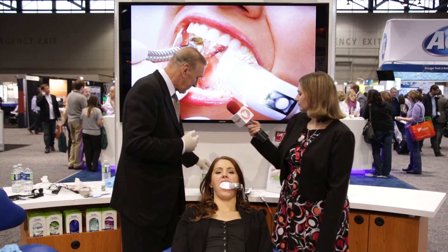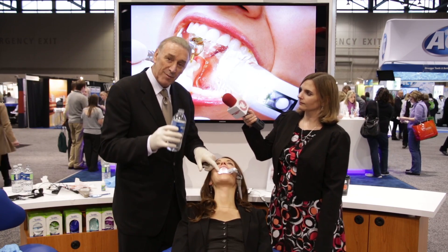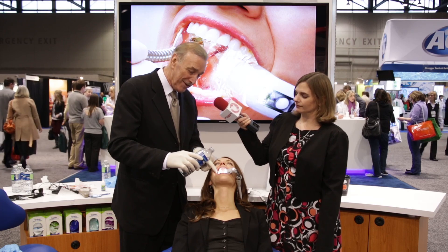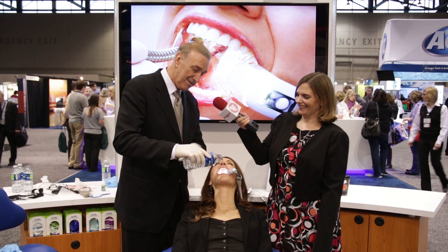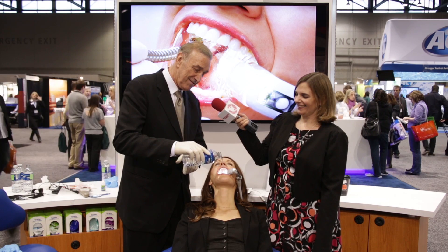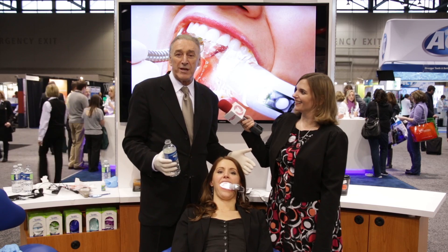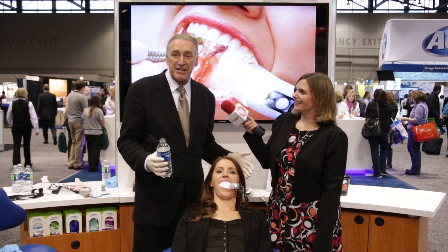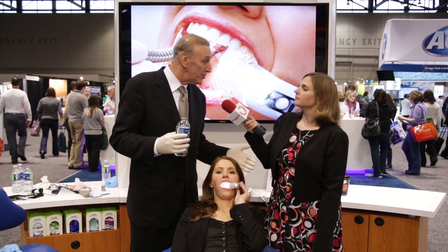I control the moisture and the humidity. And speaking of controlling the moisture, this is kind of fun to look at. We'll turn the vacuum on. I'll take a bottle of water — that's a lot of water. It's more water than we ever use in any other type of dentistry, and it vacuums it up without the aid of any additional suctioning or aspiration.